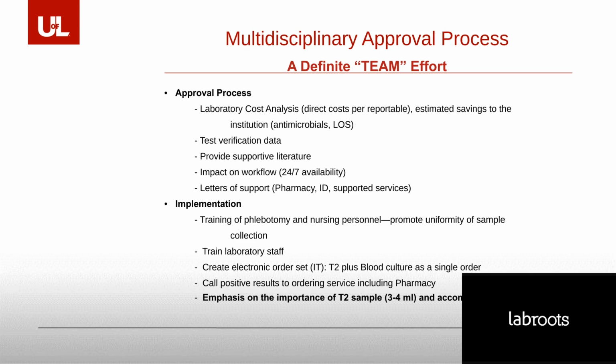For the laboratory staff, of course, for round-the-clock coverage, we trained 4 individuals to run the T2 system. We created an electronic order as well. And in that order, we have T2 plus blood culture. The purpose of that was to remind the ordering physician, if you want a T2, you also have to have a blood culture. We would not accept a T2 sample without an accompanying blood culture.